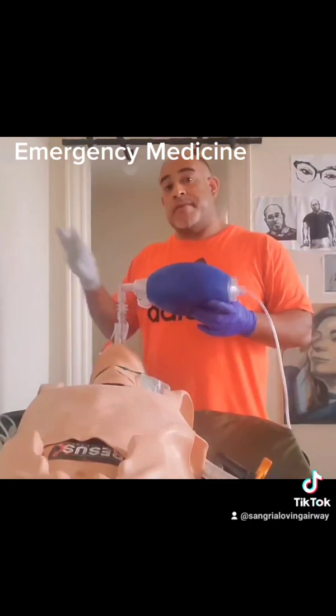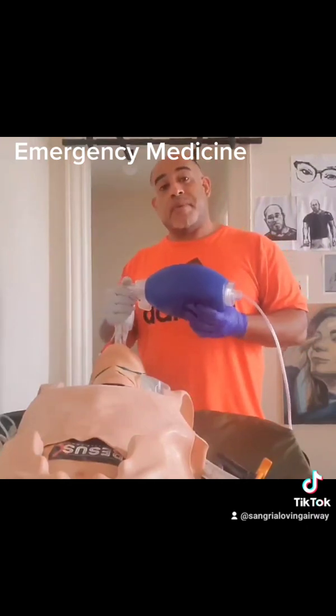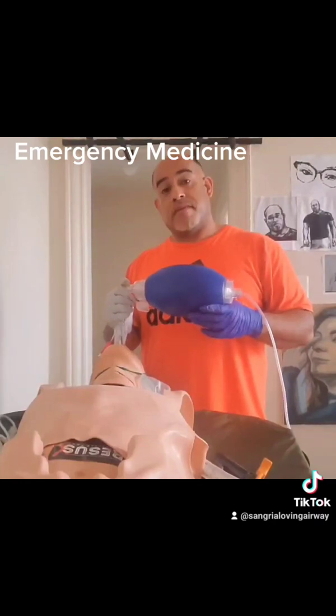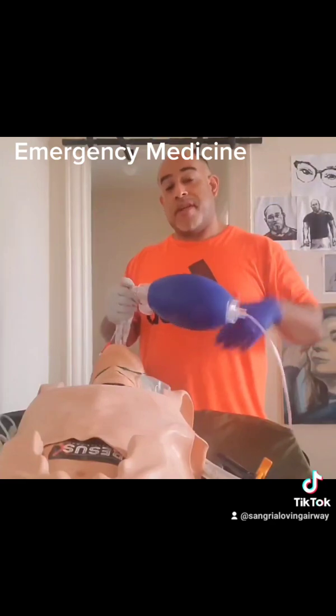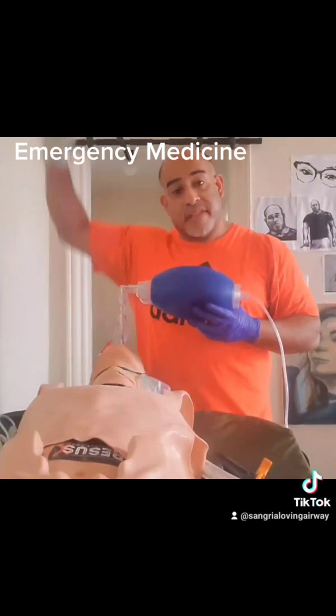Right, for 10 breaths a minute. Give him some oxygen while he's in cardiac arrest. Tell respiratory to bag gently. Be careful. Don't kill the patient. But this is something to be thought of when you have a cardiac arrest and you're by yourself. Not a team of people. Not a code arrest team.